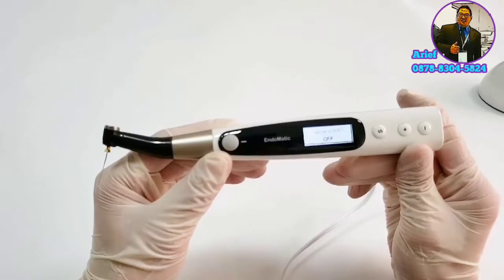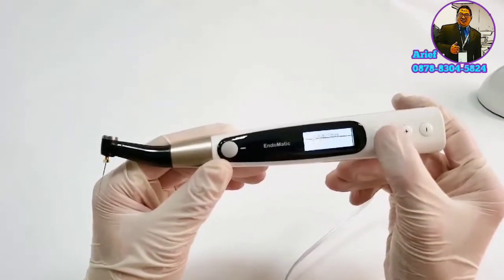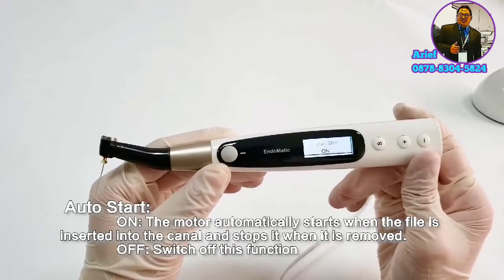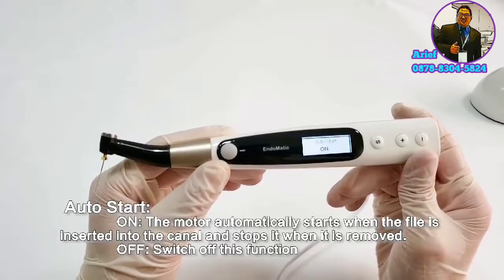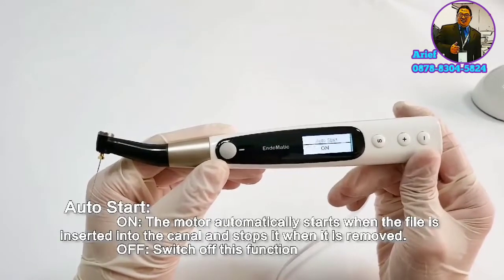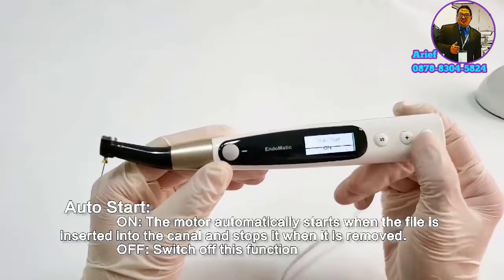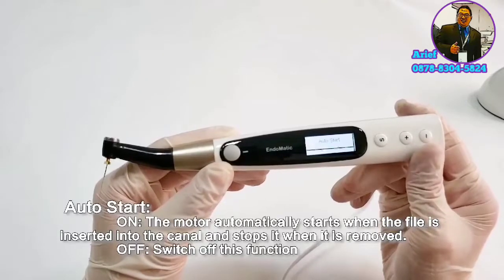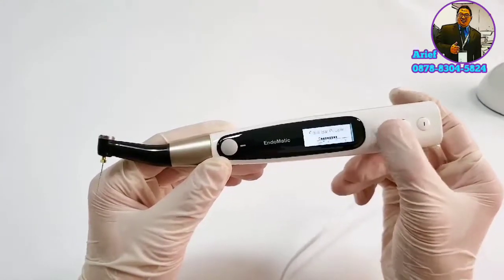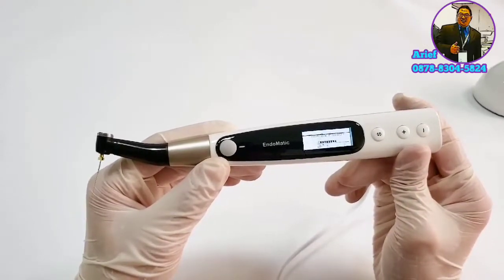Off means the motor continues to work even when the file reaches the end of the working length. After you select a mode, press the power button. Another function is auto start mode — there are on and off two modes. On means the motor automatically starts when the file is inserted into the canal and stops when it is removed. Under flash bar position mode, you can change the apical point according to your demand.